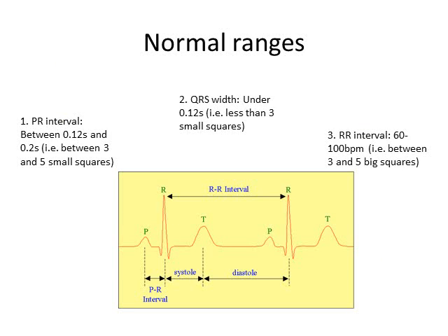So these bits are rote learning really. You need to know normal ranges in order to be able to read an ECG. And there's not that much to know in terms of rote learning. It's just these three things really.